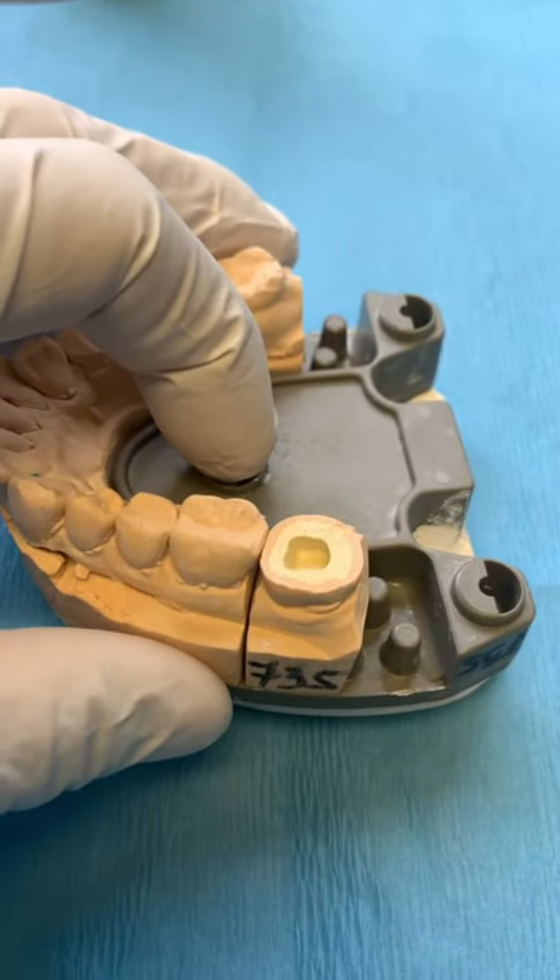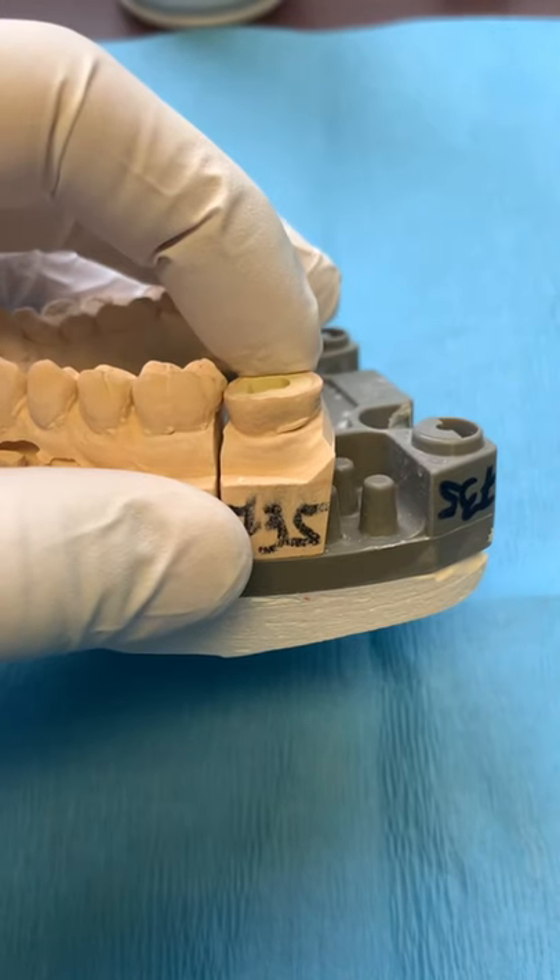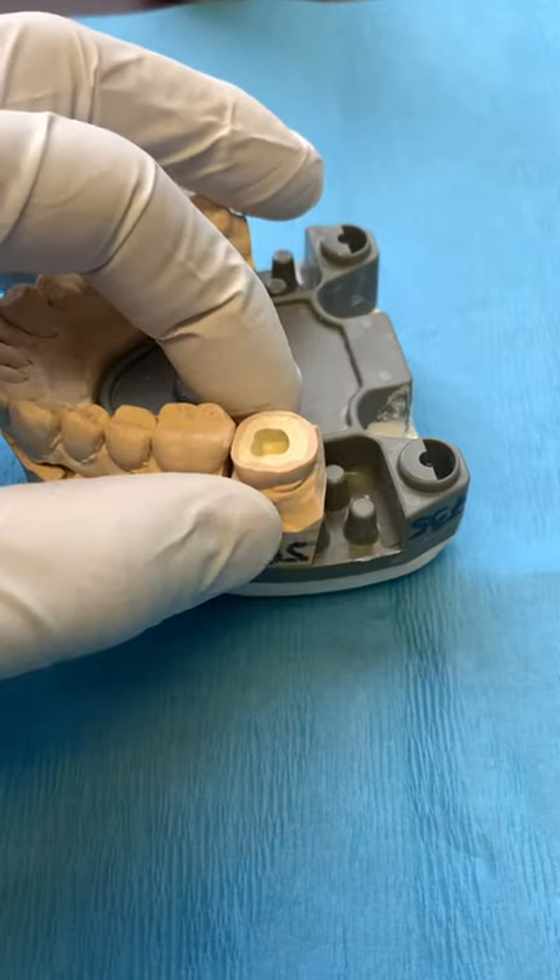So this is a really exciting case. It's dentistry, it's not that exciting, but this is a transplant. So this is tooth number 3-8 that's been placed into the 3-7 position.